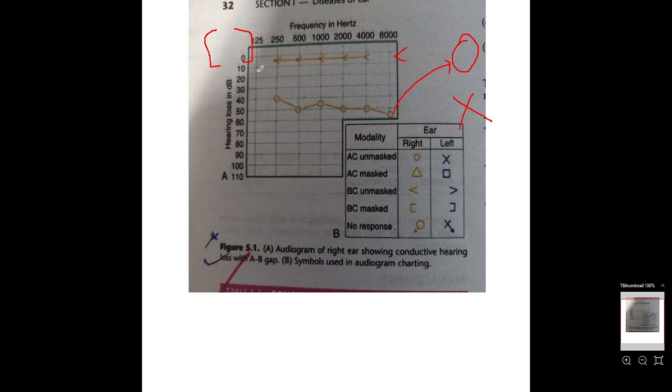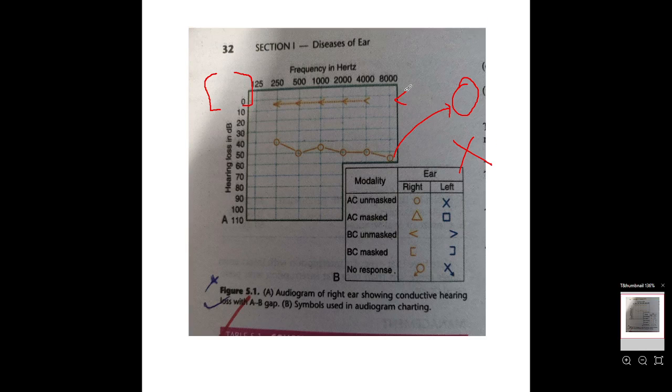Okay, so it is for bone conduction of the right ear, and this is the circle for the right ear. Okay, so this audiogram is for the right ear. Okay, we established this. Then always remember, bone conduction will be above 20 decibels. The machine takes 20 decibel as a standard, so we'll always say bone conduction will be above 20 decibels. Okay, this is the air conduction. Air conduction will always be below 20 decibels.